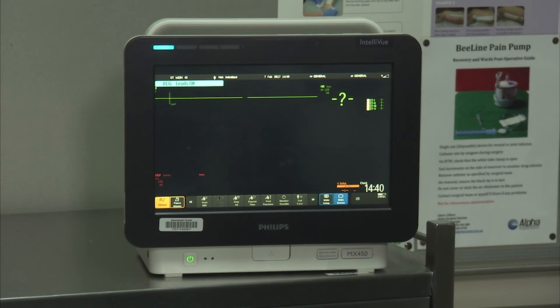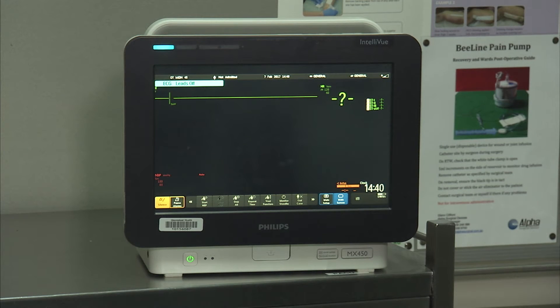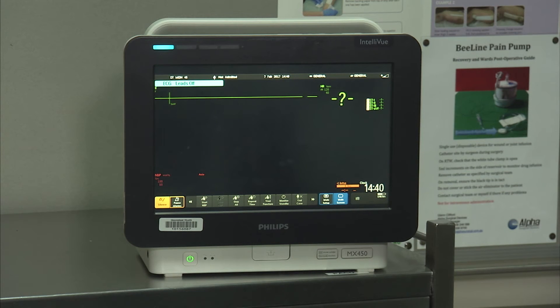Here is an MX450 monitor. These devices are located in induction bays, holding bay, and i-bays only. The Philips setup for these remains the same as the MX800 monitors. This completes your demonstration of the correct connection between your anaesthetic delivery unit and SurgyNet anaesthesia.